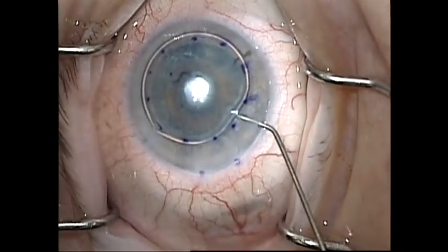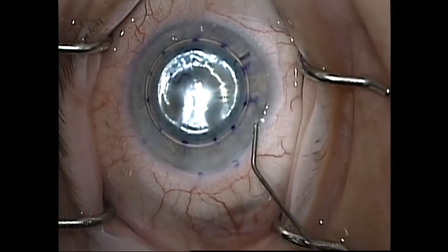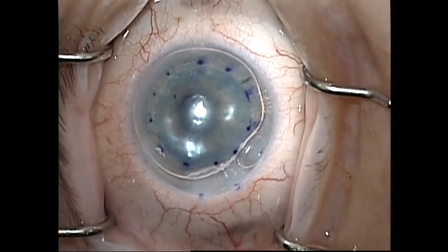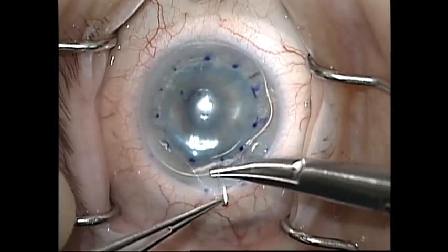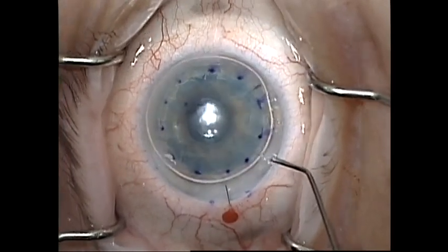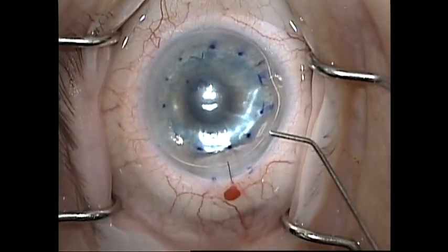After locking the graft in position, I reinflate the eye with balanced salt solution to bring it to a normal intraocular pressure. If this step is not completed and only gas is used with no balanced salt solution, gas can be trapped behind the iris, and it is important to have the eye at a normal pressure prior to adjusting the final size of the gas bubble. After the graft is fully locked in position, I like to make sure I have a suture in the main incision. I like to be safe and place a suture in the main incision as this prevents any loss of graft support should the patient happen to rub their eye. After the graft is securely in position and the suture is tied and the knot is buried, I like to elevate the pressure to approximately 40 to 50 mmHg for about two minutes. I feel that this helps to promote adhesion of the graft and prevent graft detachments that may lead to rebubbles.